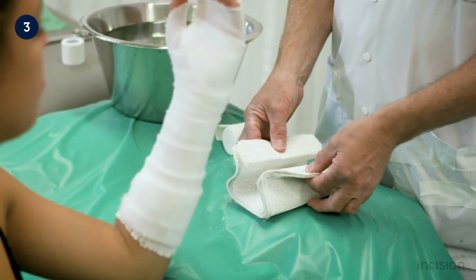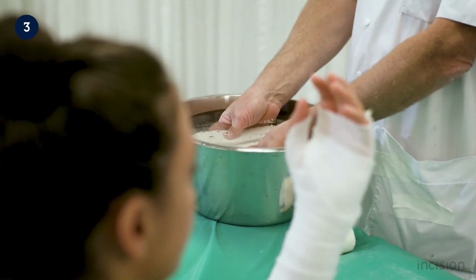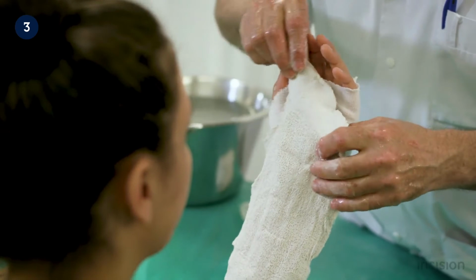The plaster is folded in a corrugated fashion, as now shown, and then dipped in the water for a few seconds. Excess water is now squeezed from the plaster, and it is then applied over the volar side of the forearm.